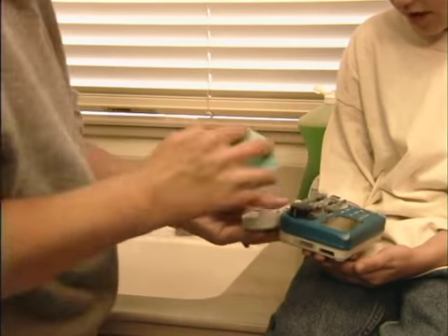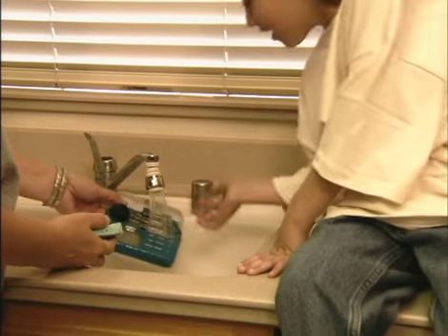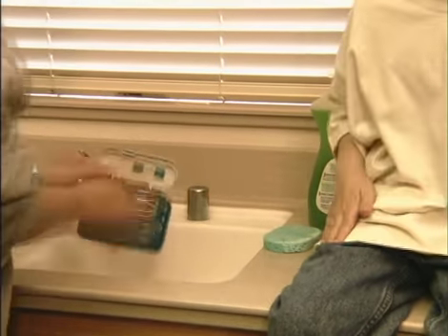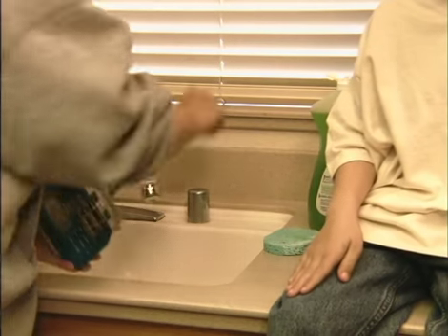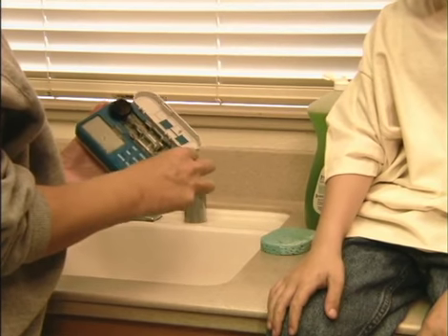Rinse the pump by moving it under a stream of warm water. Then dry it with a clean cloth. Only adults should use the bleach or disinfectant to clean the pump. Finally, use a cotton swab to gently clean the pathways of the cassette receptacle, and the EnteraLite Infinity is ready for its next use.